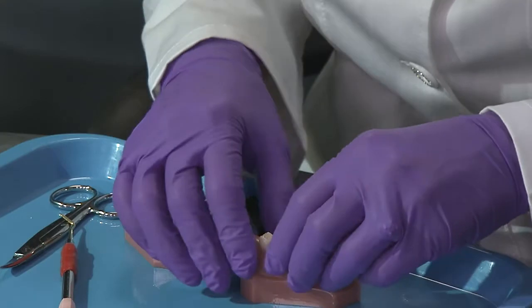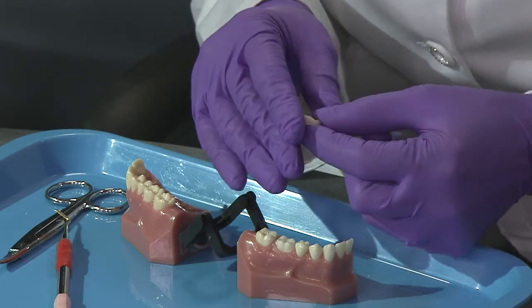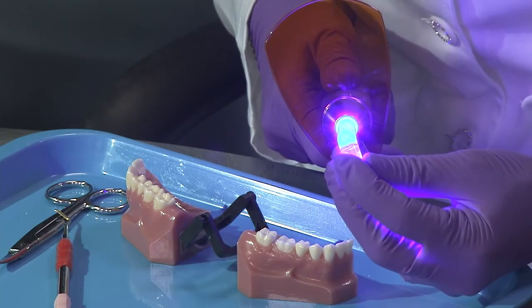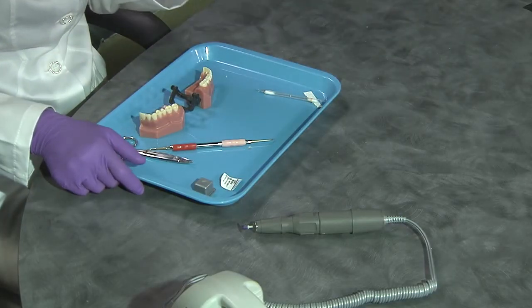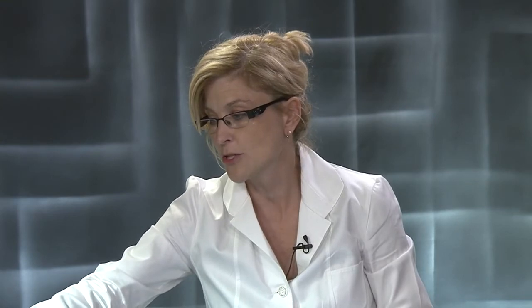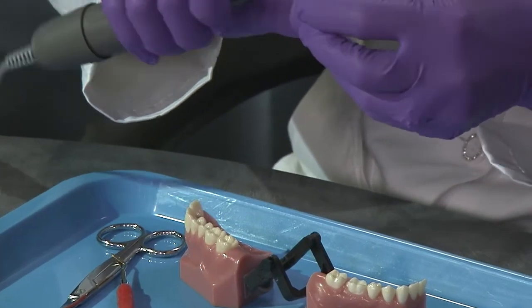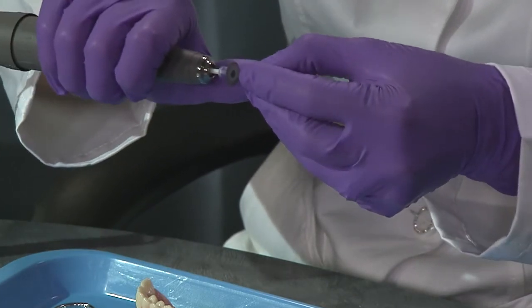I'm going to make sure that I've got any little areas that look like we need to adjust — and I don't. I'm actually really happy with that, so I'm going to remove it. The more time you spend, the less trimming you're going to do. I'm going to take my CureLite before trimming and sit it right inside to make sure it's really cured. Depending on the CureLite — with this one it's cured, it's a really, really strong light. But sometimes other lights in practice will not cure as fast. The only thing you really should have to do at this point is maybe take a sandpaper disc. I'm going to use a little SuperSnap from Shofu and just barely dust it. You should not have to spend any time doing this. The secret to not having to spend any time is utilizing that spatula and getting those margins.